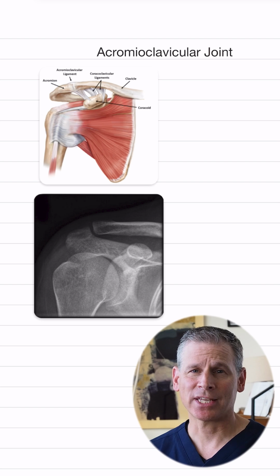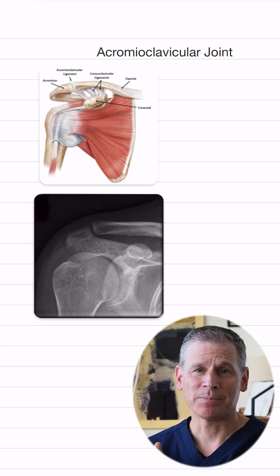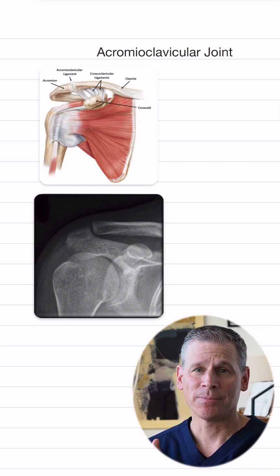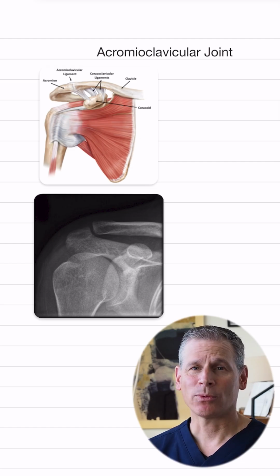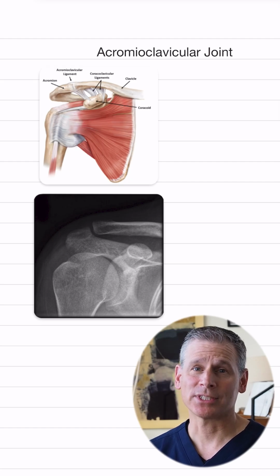So just like your skin, you can get wrinkles or changes in the color of your skin around your shoulder, but that's not what's causing your pain in your shoulder. Similarly, there are structures inside your shoulder that will have just normal changes that we see on an MRI, but that's not necessarily what's causing your pain. And that's not what we may need to worry about in the future. So let's talk about each structure and what is common wear and what is not.